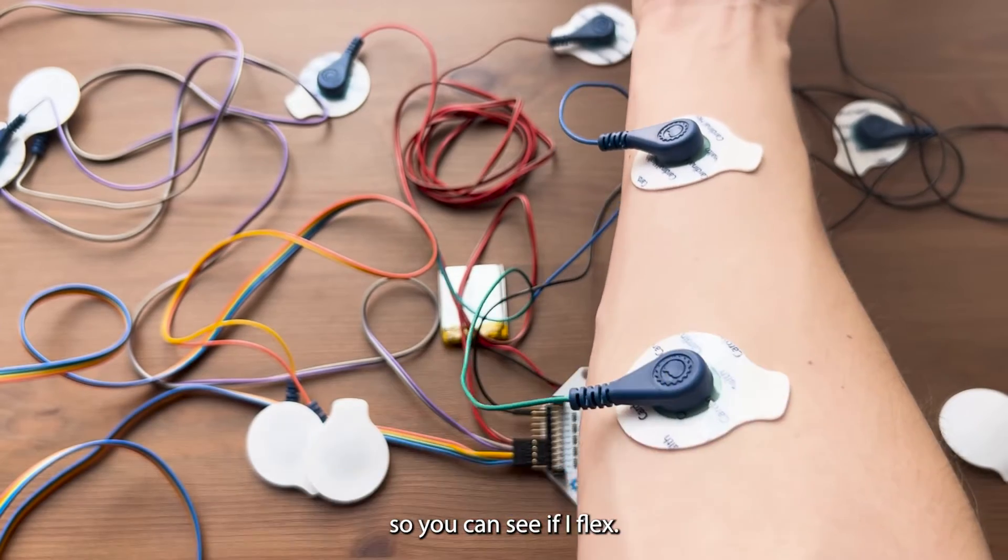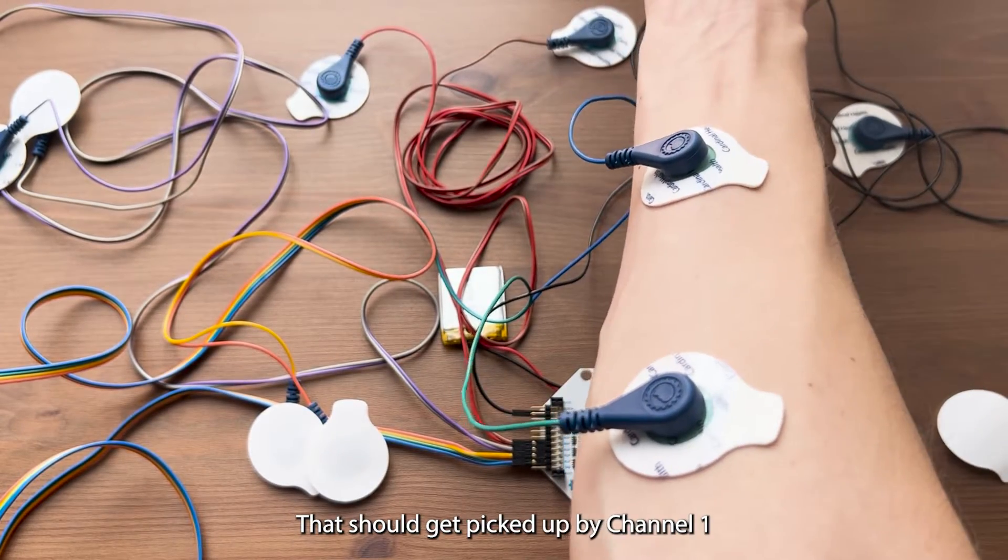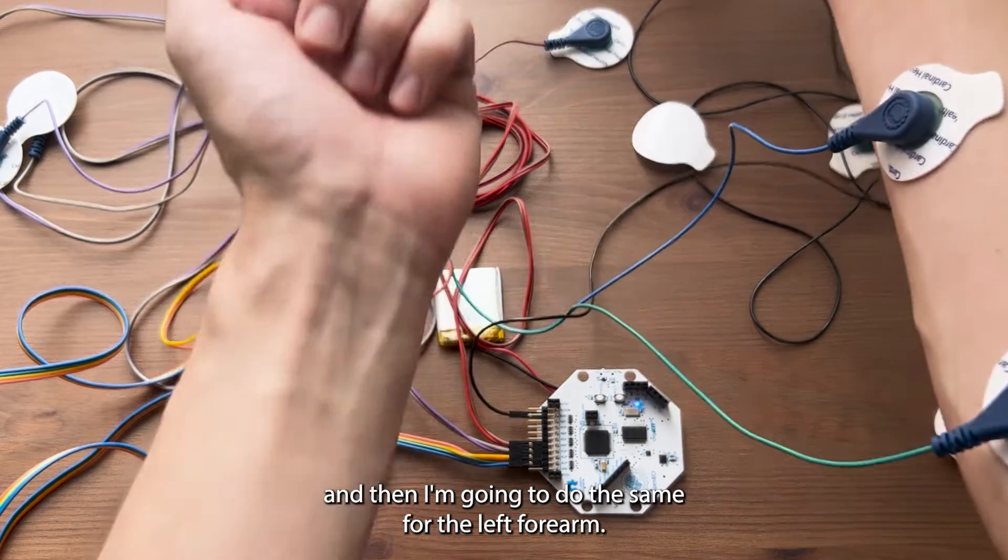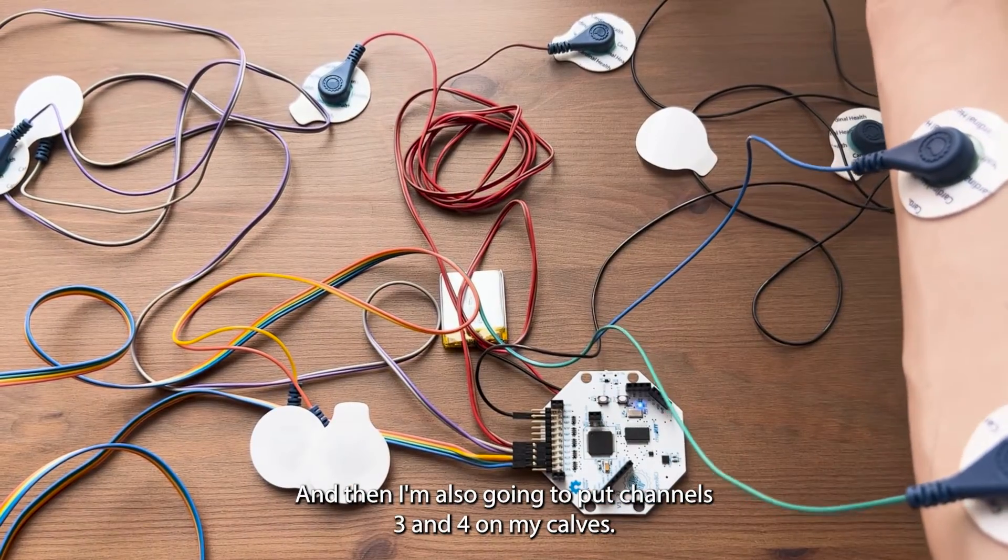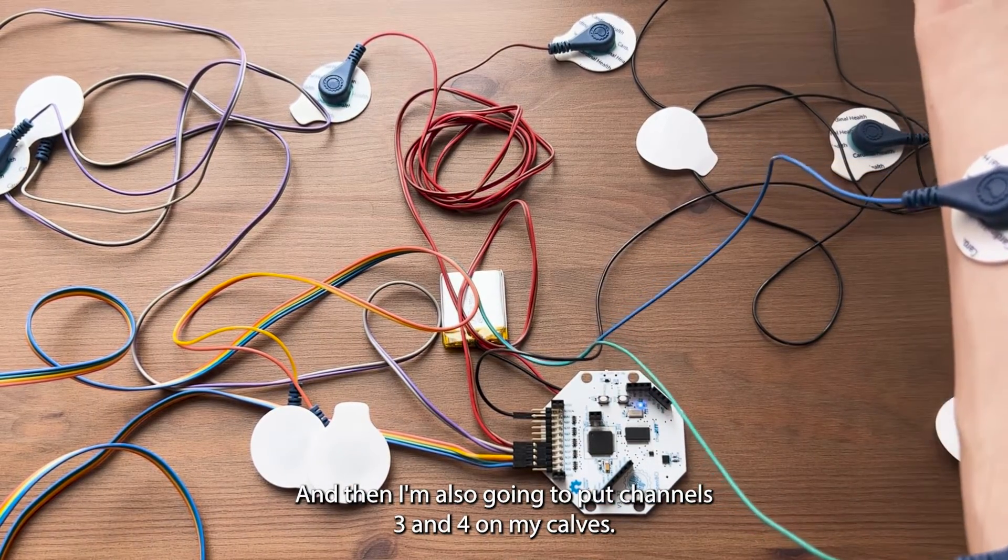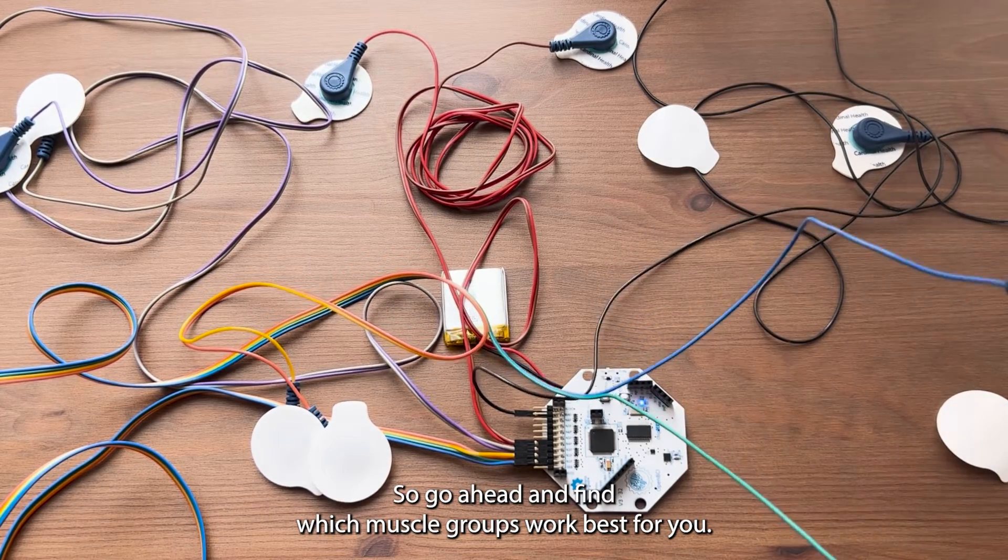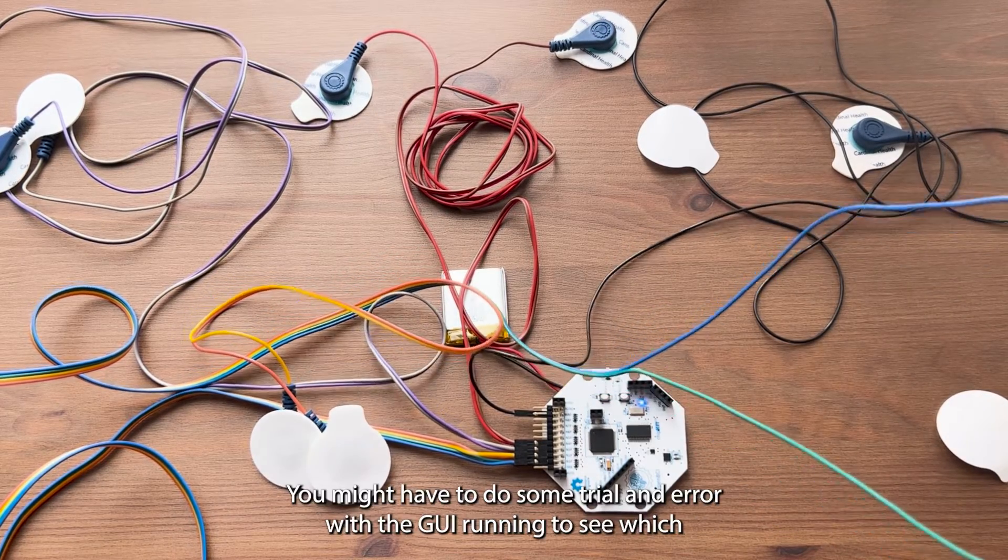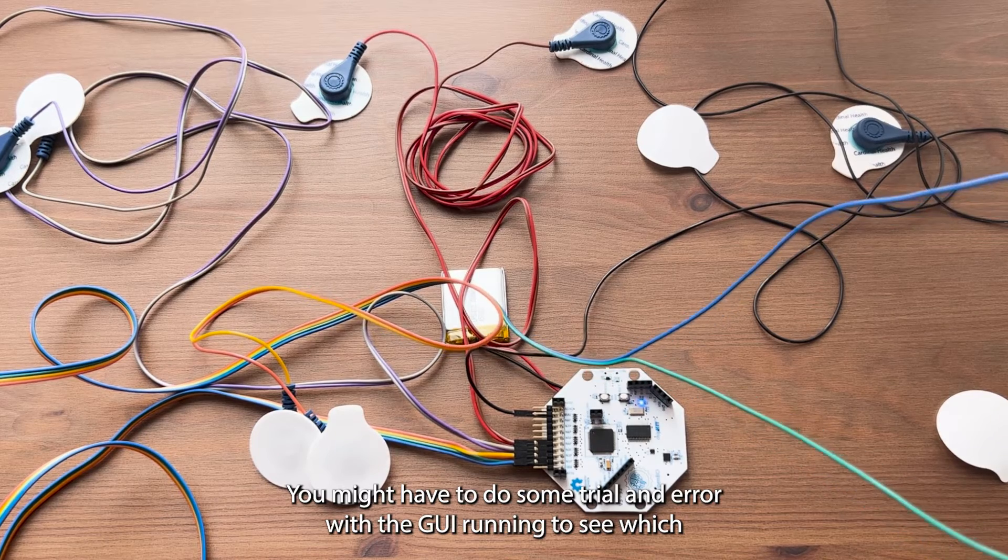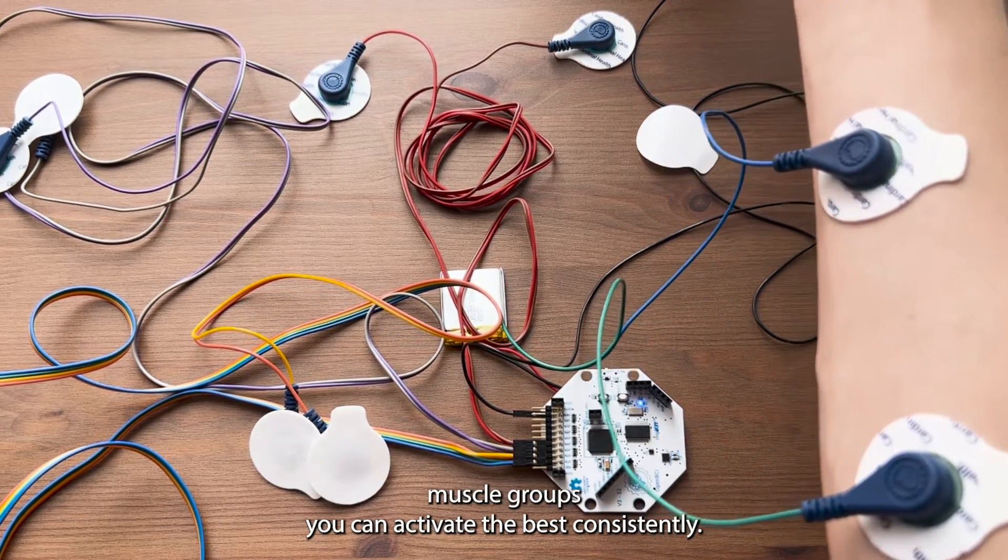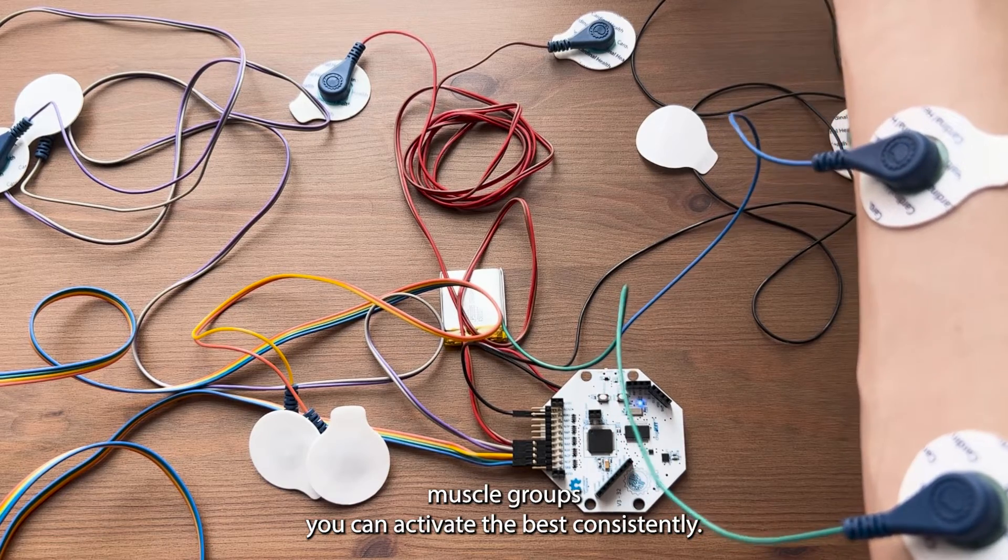If I flex, that should get picked up by channel one. And then I'm going to do the same for the left forearm and then I'm also going to put channels three and four on my calves. Go ahead and find which muscle groups work best for you. You might have to do some trial and error with the GUI running to see which muscle groups you can activate the best consistently.